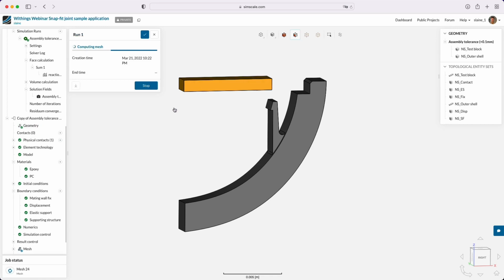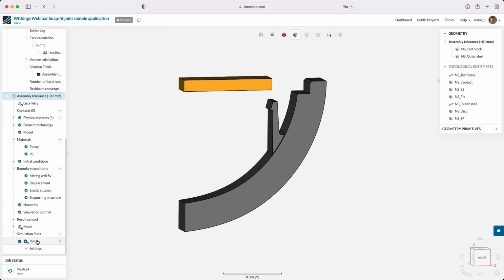And while that's running, I'll just show you the steps that we've gone through. So this is actually the plus 0.1 assembly tolerance. And we'll give that same name to the simulation that we've got running now.